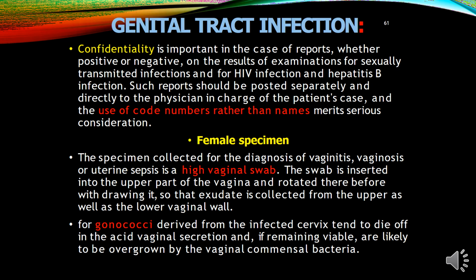Genital infections. For genital infections, confidentiality is important, and case reports, whether positive or negative, on the result of examination for sexually transmitted infections, HIV infections and hepatitis B infections should be posted separately and directly told to the physician in charge of the patient's case, and the use of code numbers rather than names merits serious consideration. Female specimen.